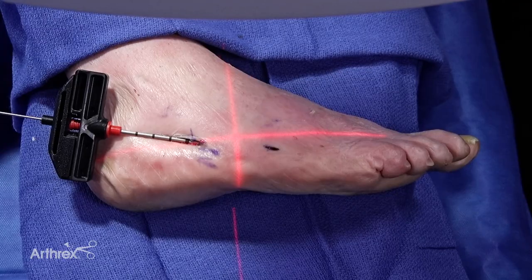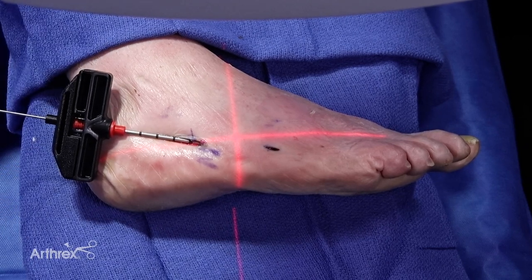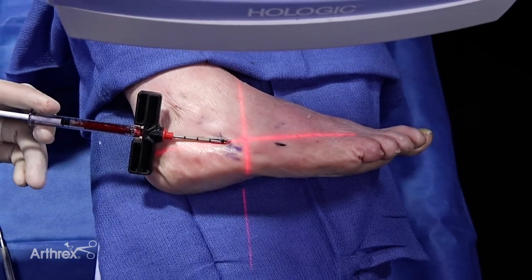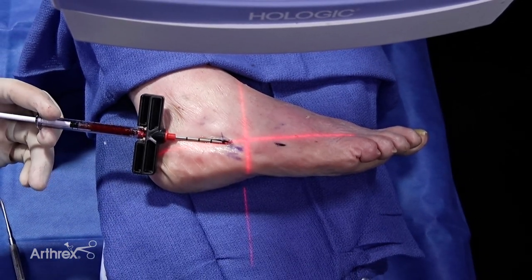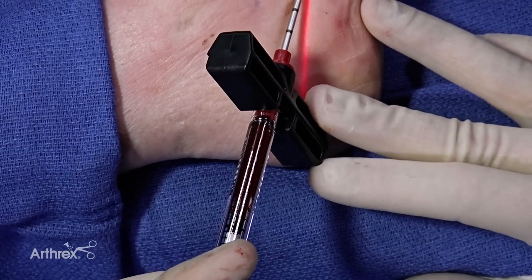First, I would inject into the intramedullary space until you can see where the fracture is. I will then advance the Tuohy needle to that site, and once you can see under fluoroscopy that you are at the site of the fracture, you can connect your syringe with the BioSurge product. Under fluoro at that site, I will then advance and add some of the product into that intramedullary space.